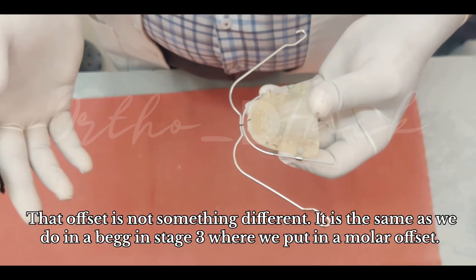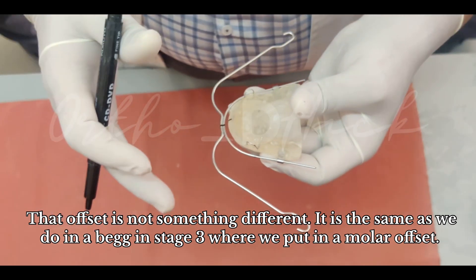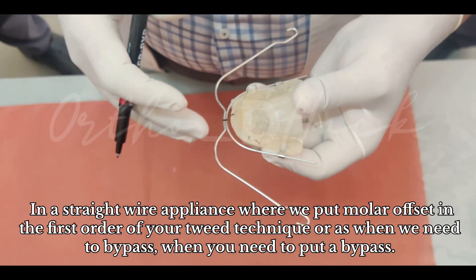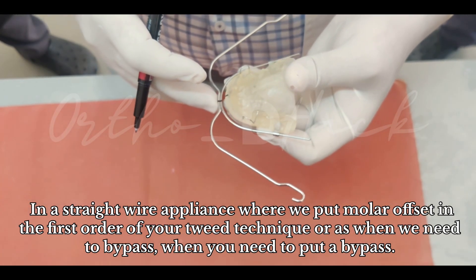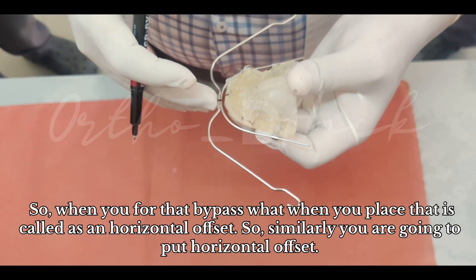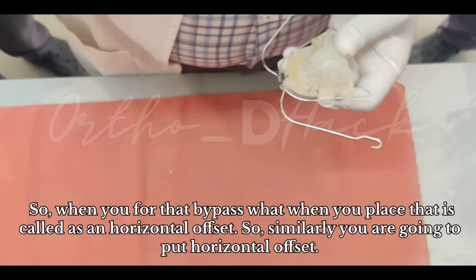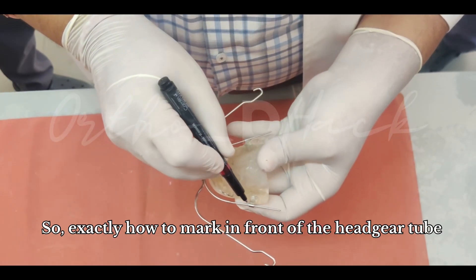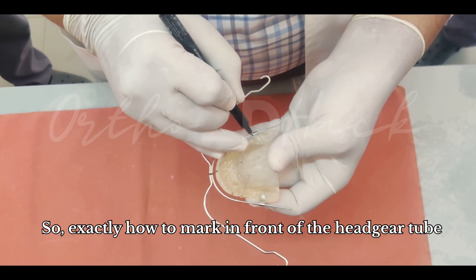In our department we usually follow placement of an offset in the face bow. This offset is similar to what we do in stage three where you put a molar offset in a straight-wire appliance, or when you need to put a bypass — that bend is called a horizontal offset. Similarly, you are going to put a horizontal offset, marking exactly in front of the headgear tube.